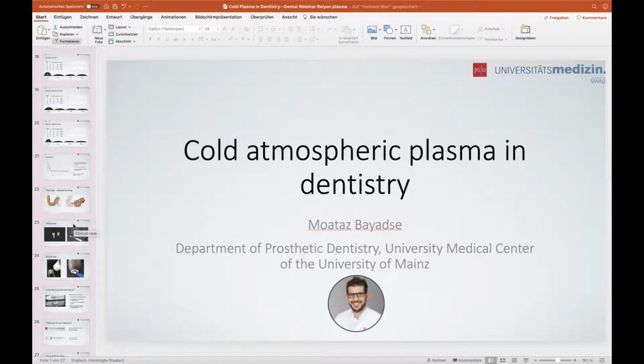The hydrophobic recovery is noticed after 1 day, actually. But if you treat your crowns or restorations immediately before you bond them, you don't have to worry about that.